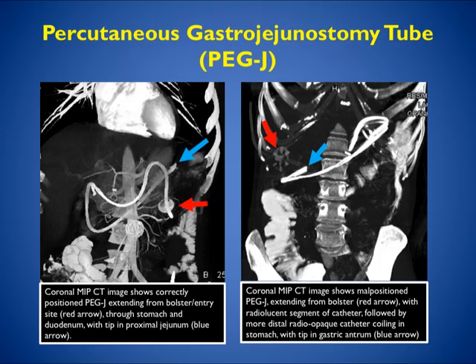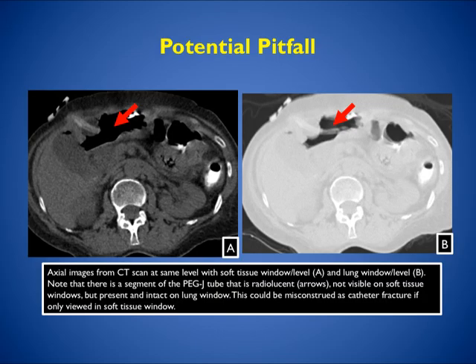Here's a good example of a percutaneous gastrojejunostomy tube, the PEG-J. The coronal MIP shows the PEG-J extending from the bolster entry site through the stomach and duodenum with the tip in the proximal jejunum, indicated by the blue arrow. The coronal images also show a malpositioned PEG, extending from the red arrow with a radiolucent segment of catheter followed by a more distal radiopaque catheter coiling in the stomach with the tip in the gastric antrum. With a PEG-J, you need to follow it through the stomach, through the duodenum, and down into the jejunum — if it's not there, it's incorrectly placed.